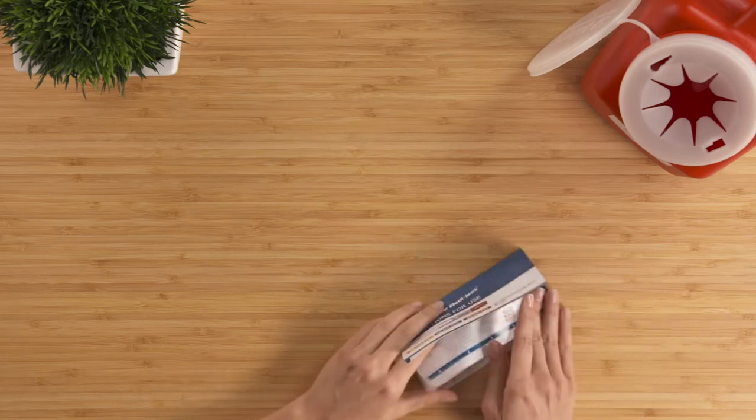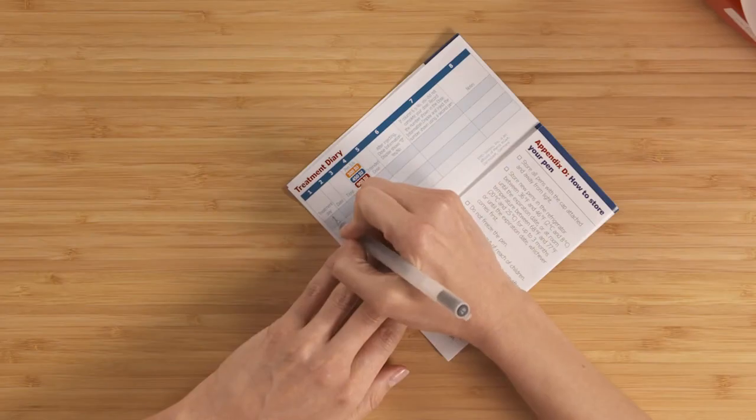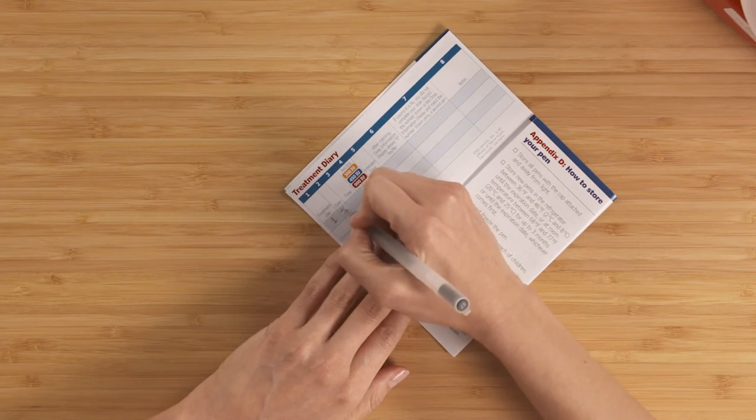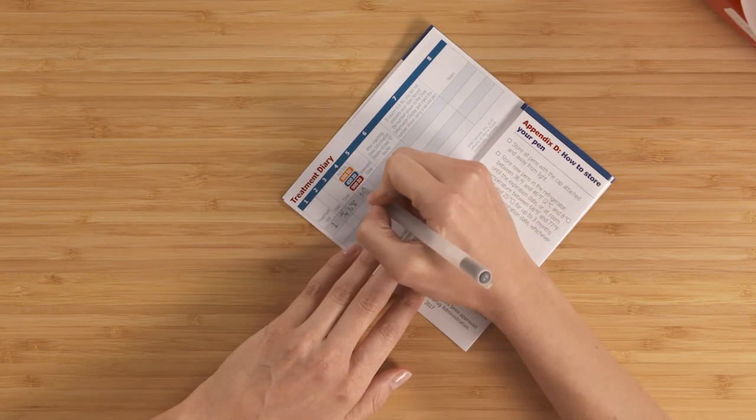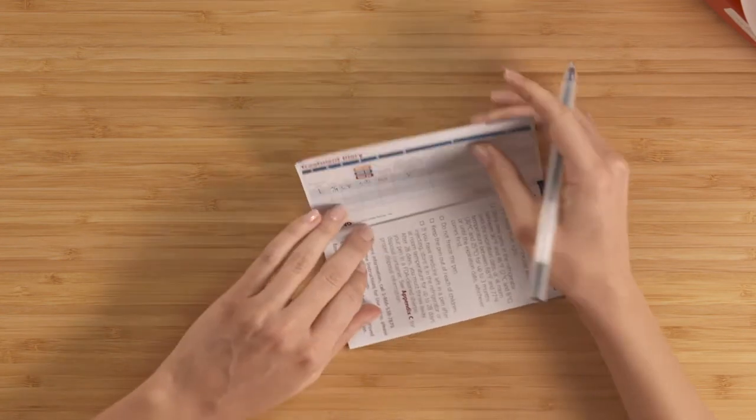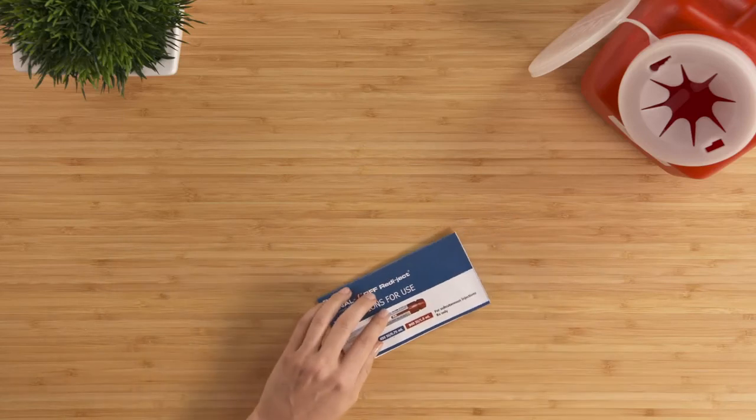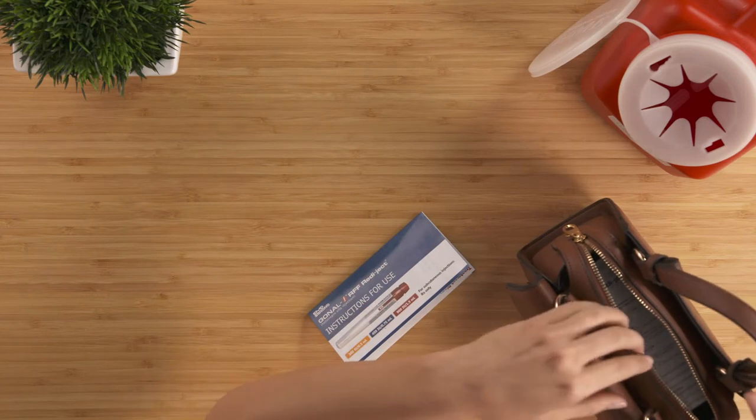In your instructions for use, you'll notice a treatment diary, which can be cut or torn off. With this, you can record your injection, the last step of the instructions for use. This step is optional, but I find it's a great way to keep track of my injections to ensure I'm always taking the right dose. I take this with me to appointments for reference, so I know exactly when and how much medicine I've taken.